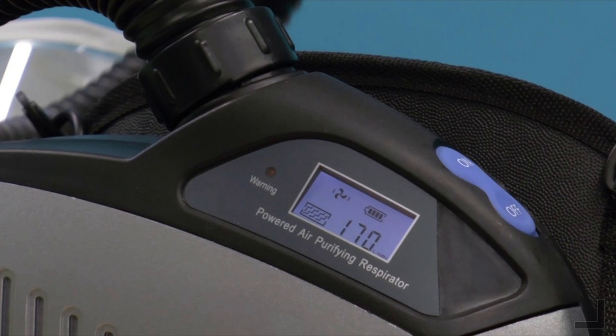The HEPA filter is expected to last for one year. The display screen shows the condition of the filter and will indicate when the filter needs to be changed.